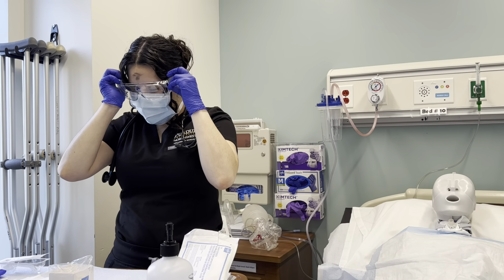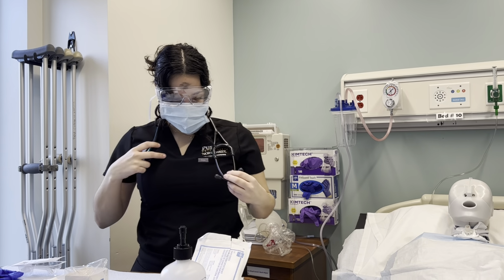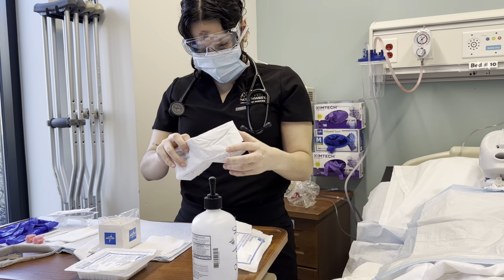And then I will go ahead and dispose of these gloves. Carefully grab my sterile gloves and put them on.